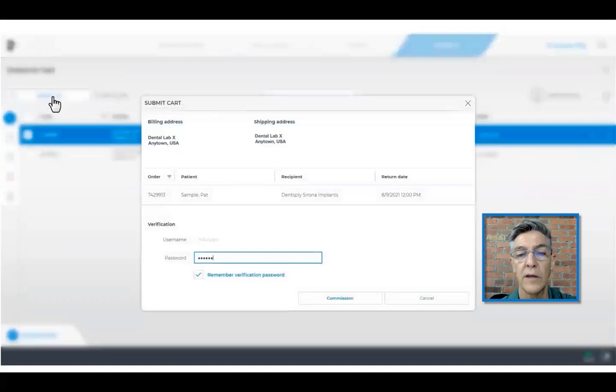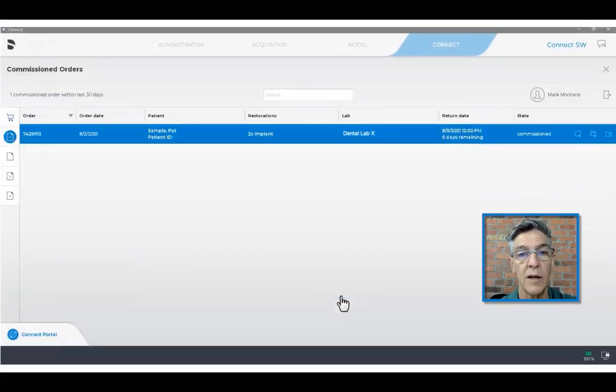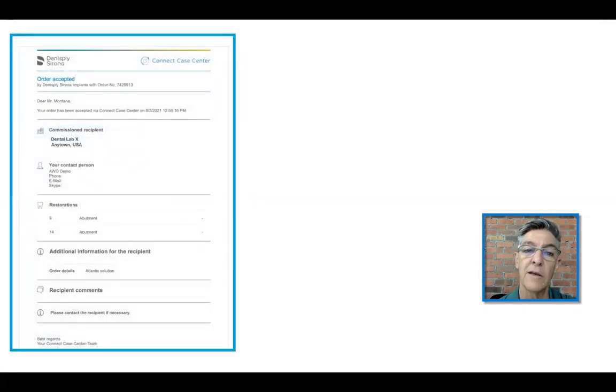Then we send this — we submit the cart, give it the okay, the commission, move forward and it's been done. Once this is sent, an email comes back to you telling you that the information has been sent and accepted by the dental laboratory.